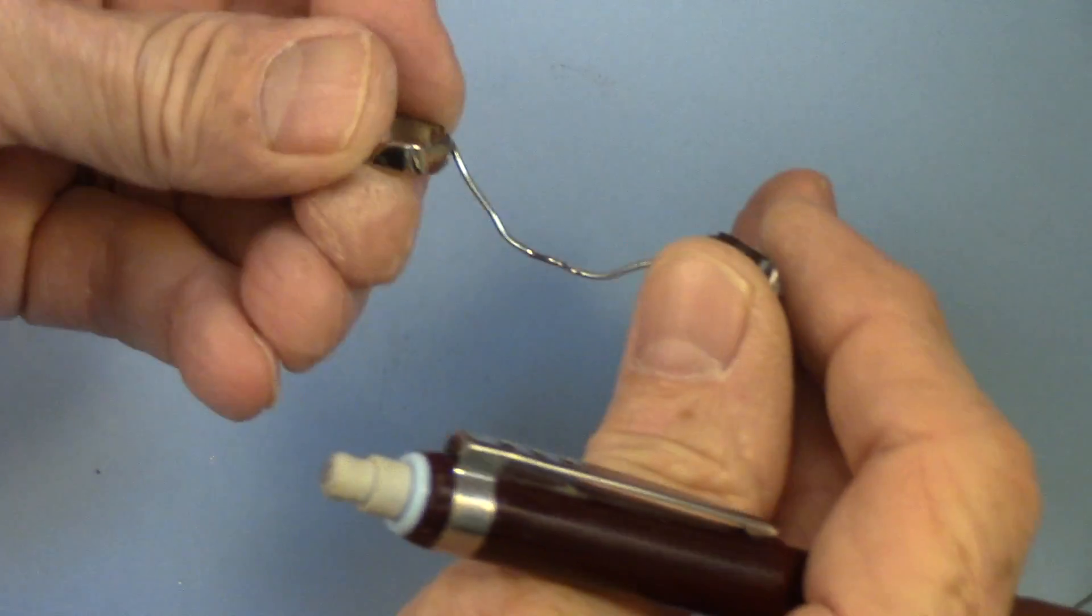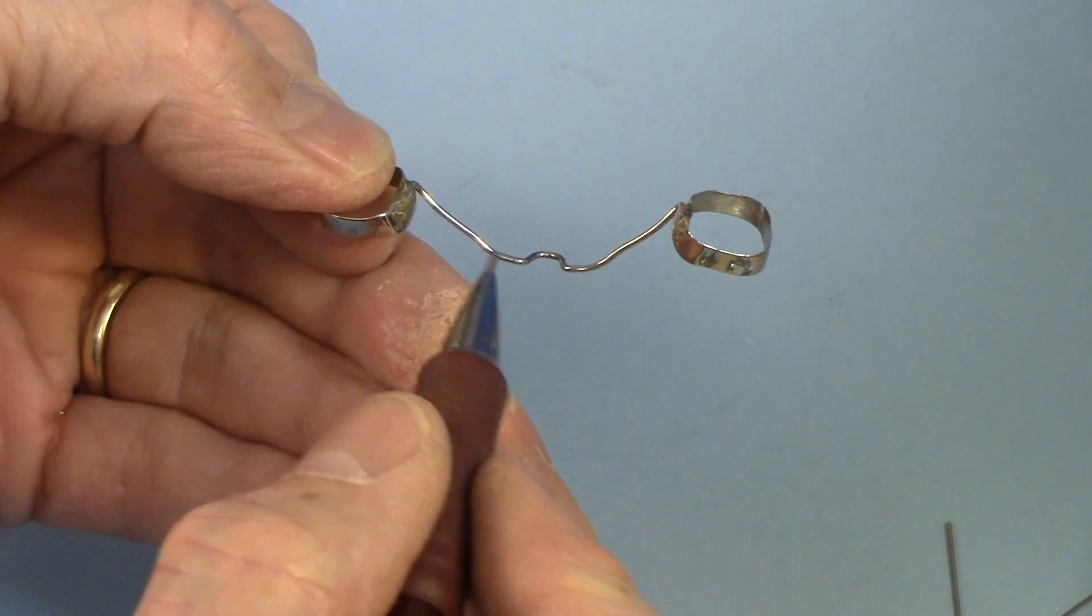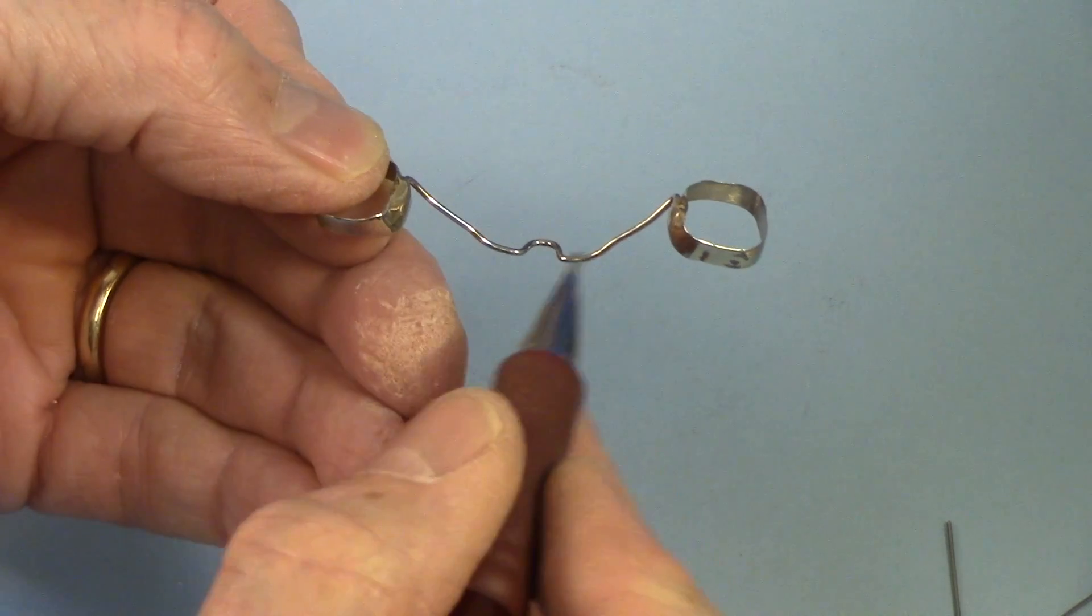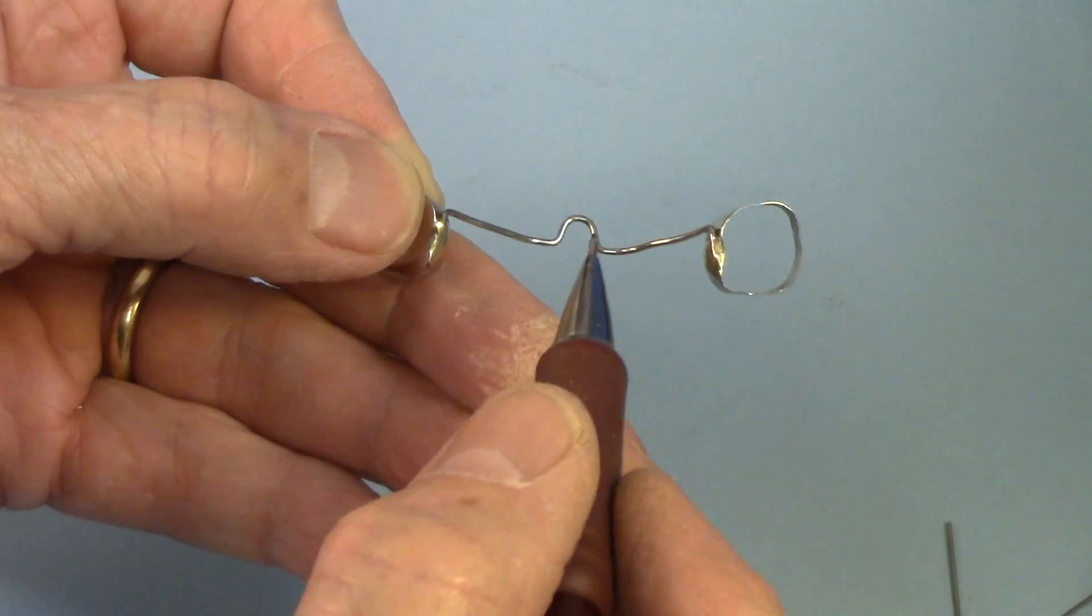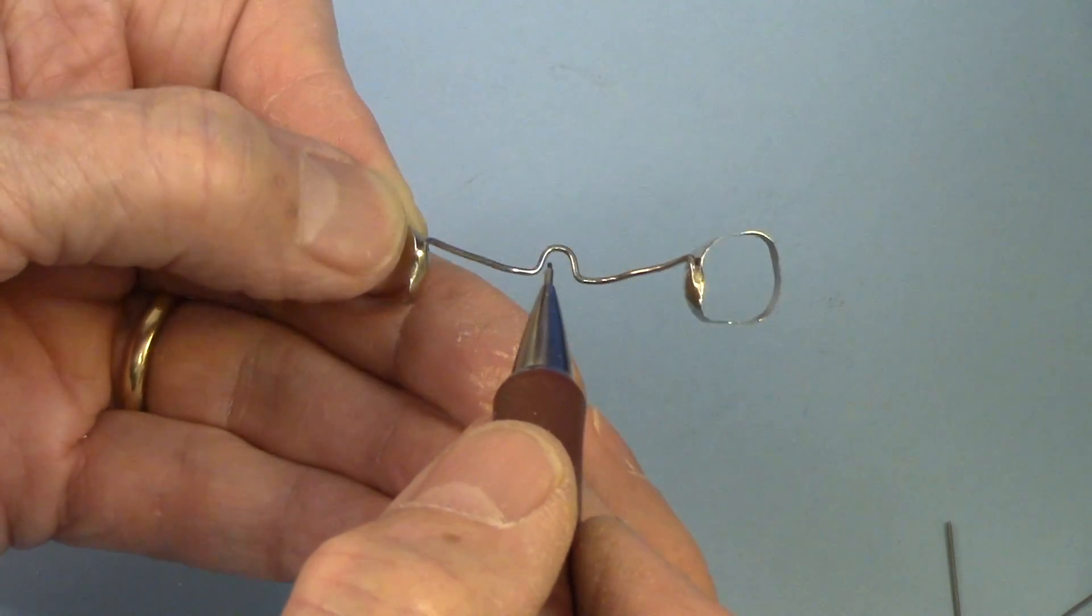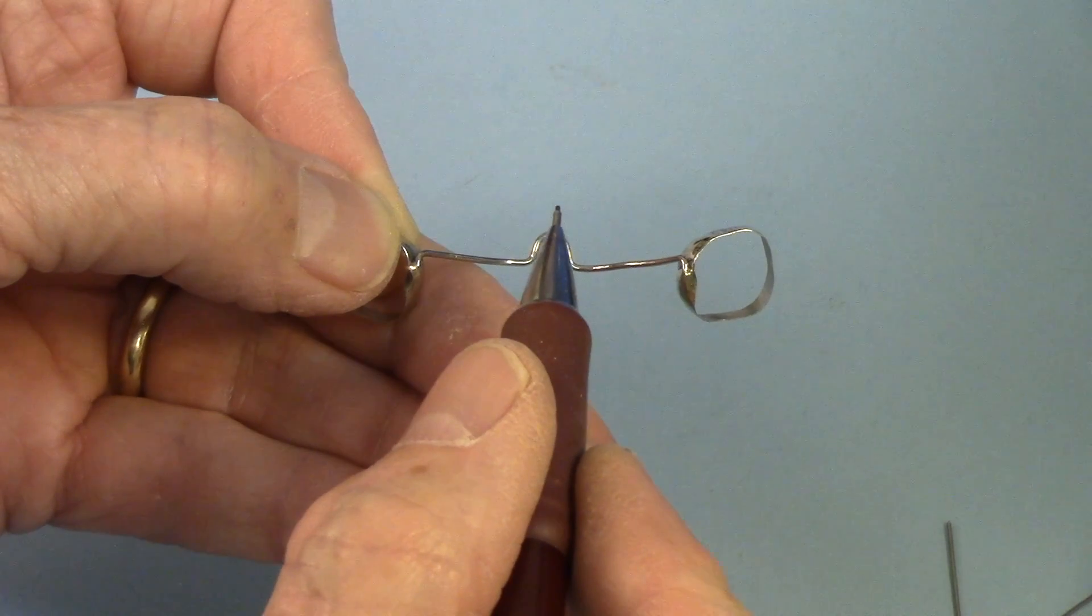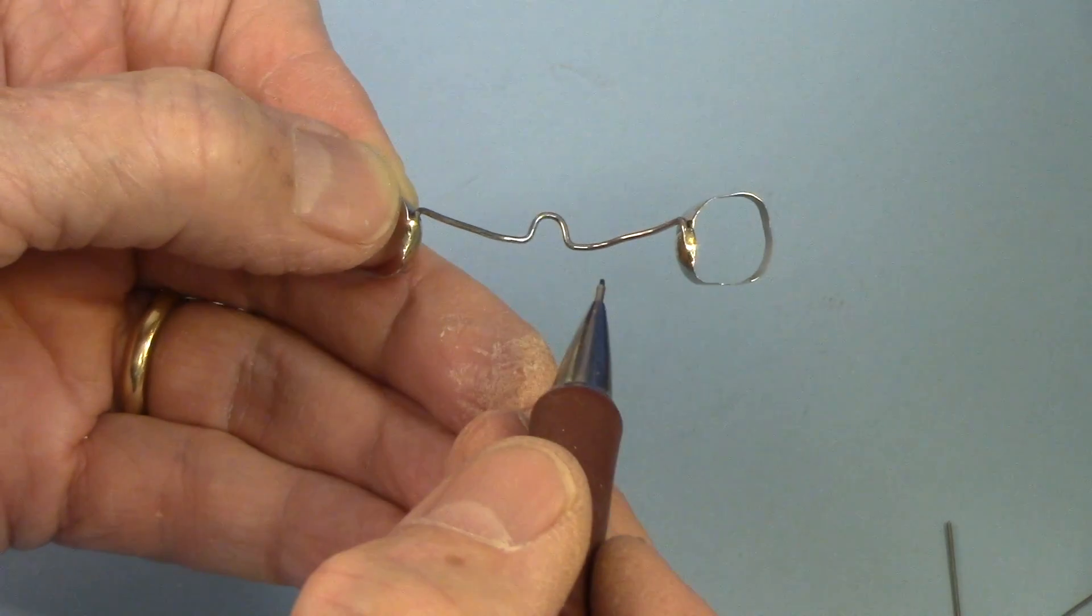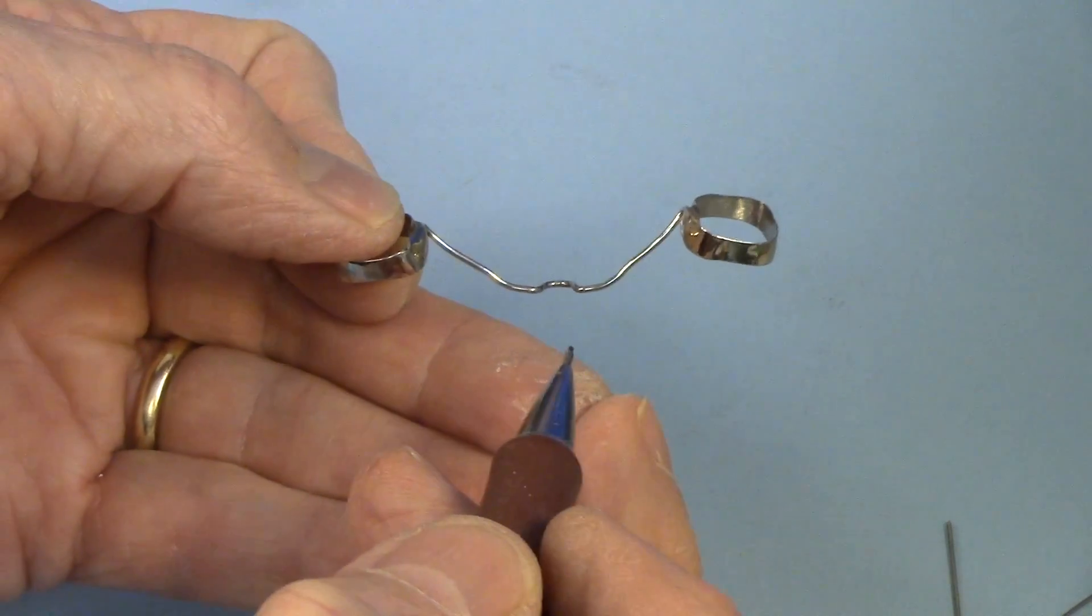If you've got something like a trans-palatal arch, it goes across the upper. If it's for just holding the arch, you can use like a half or three-quarter temper. But if you're going to use it to expand, like a lot of times, this will have extensions that go along the lingual of the bottom. And this loop will be more like an Omega shape here. So that the doctor can adjust it to cause expansion. If that's going to be the case, you need to get the more springy tempered wire.